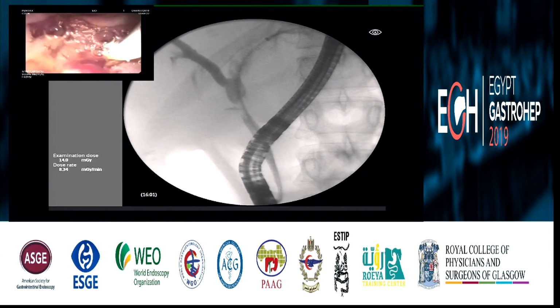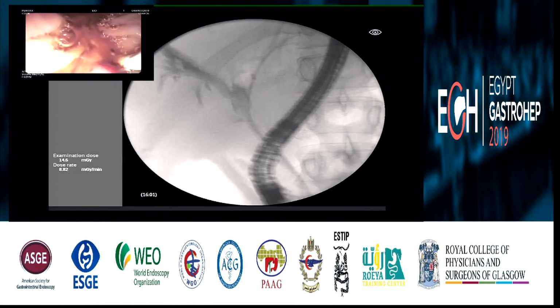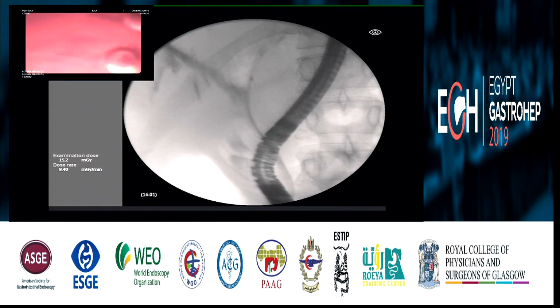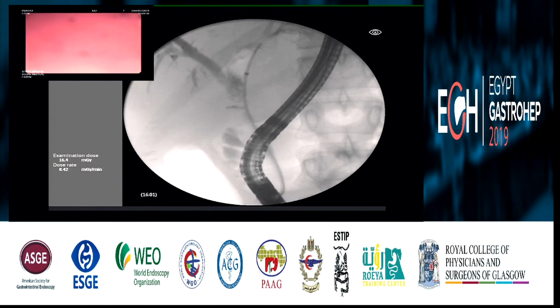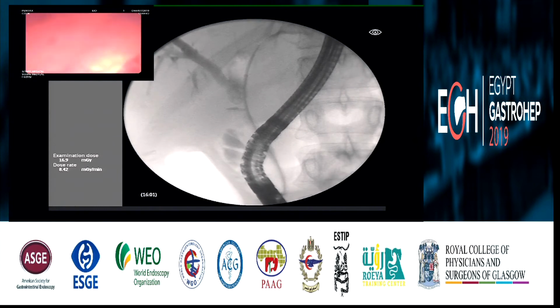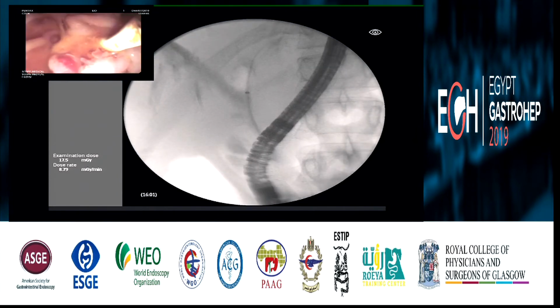So I want to see what is there on the left. Inflate a little bit. Okay. Ivo is going to calibrate the stricture. Too much inflated. It's like this. Look, I'll show you. Okay, let's try it like this. There's minimal inflation. Too much also now. Can you deflate more, please?